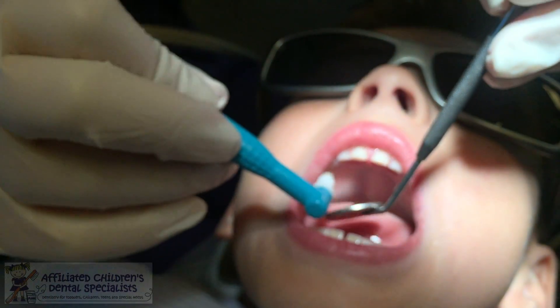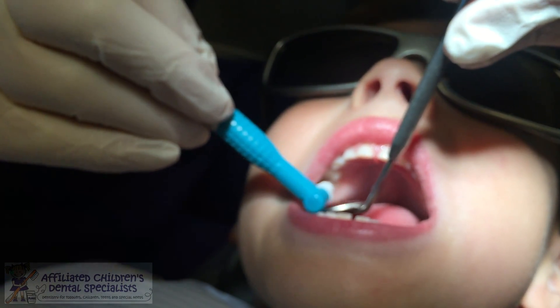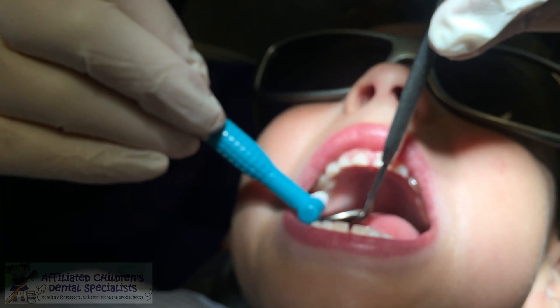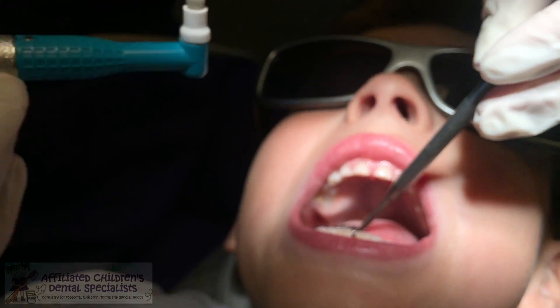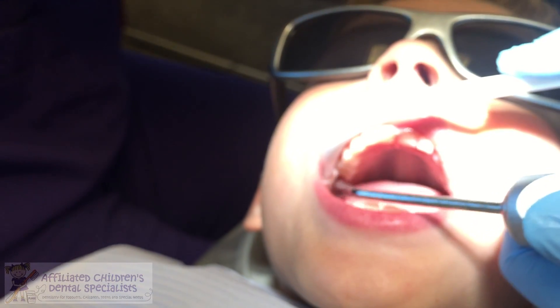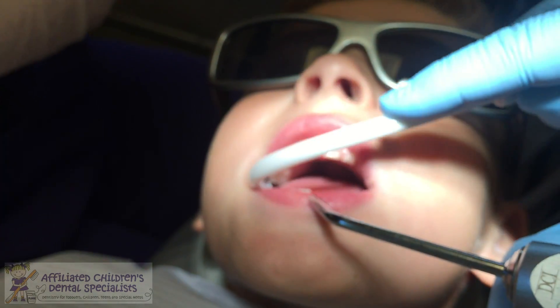So what we're going to do first is I'm going to clean your tooth with a little pumice. So we're going to brush it out. This is pretty firm. You would want to remove any mush that would be in the cavity, but this is nice and clean, so I'm just going to pumice it out. Some of these smart restorations are going to need a little bit of cleanup with a handpiece, a slow speed, or a spoon excavator. In this case, it's just not necessary. His saliva was already trying to arrest the lesion.